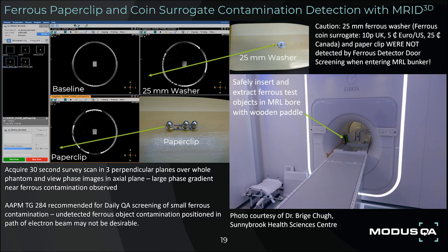It is noted that ferrous contamination of the MR system bore is a common occurrence in the clinical workplace. Items such as coins, paper clips, and hairpins are commonly found, despite screening systems which may not always detect small ferrous items. In an engineering test of ferrous content detection with MRID 3D, various ferrous items are safely placed in a magnet bore and phase images of the axial localizer, acquired in under 30 seconds, can be viewed as a sensitive test to detect paper clips and coin surrogates. Multiple phase-wrapping artifacts are clear when a paper clip or coin surrogate are introduced into the MR bore and detected by MRID 3D. The AAPM Task Group 284 recommendation is for daily screening of ferrous contamination in MR-SIM systems and, by extension, MR-Linac systems.